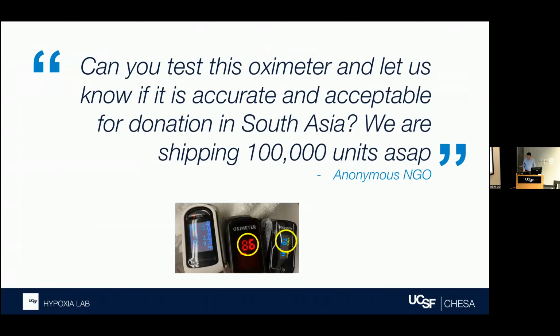Another major impetus for starting the Open Oximetry project was requests like this from NGOs. So in the midst of COVID, we started seeing large-scale donations for pulse oximeters, and multiple large donors started asking us about performance of devices.